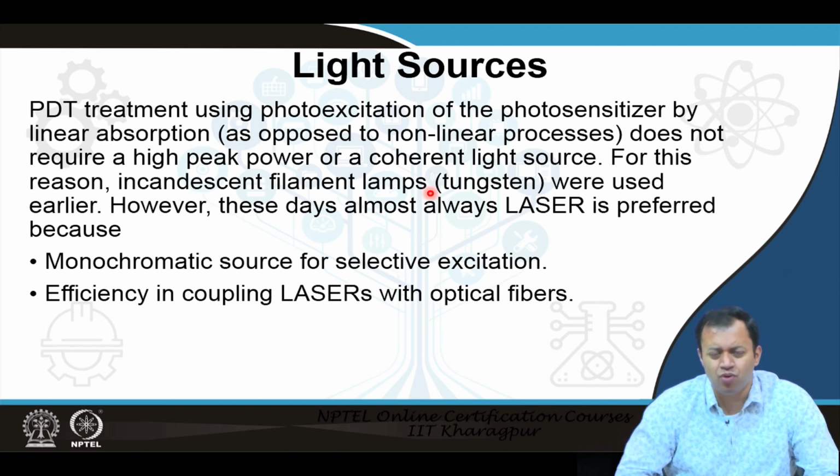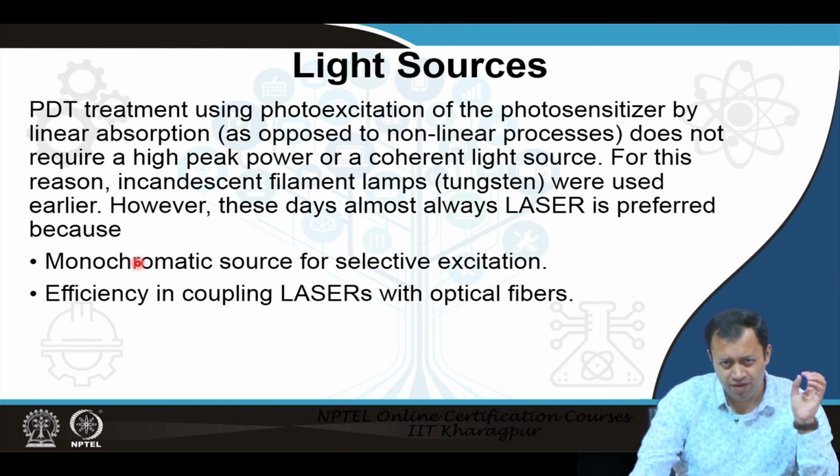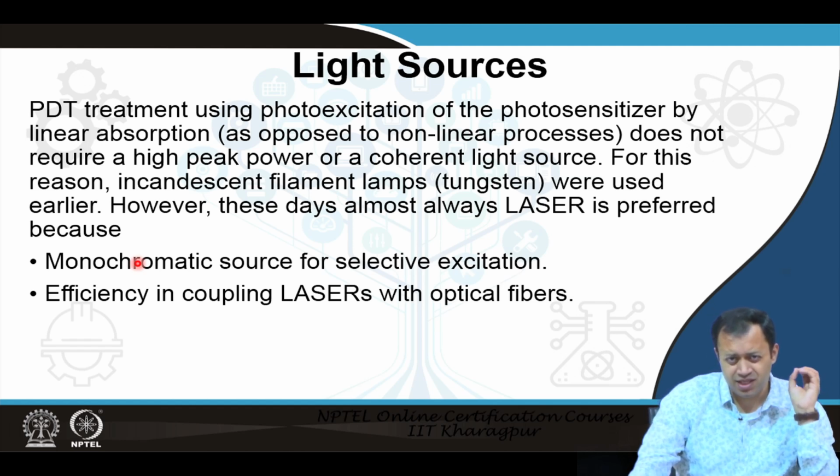So, overall it is the sensitivity of the drug to a particular wavelength, and since it is more or less a linear absorption process, especially if the drug is applied externally to your skin, you do not require a laser light source. However, we use laser simply because it is monochromatic, with a very selective wavelength, so it can be selectively targeted.